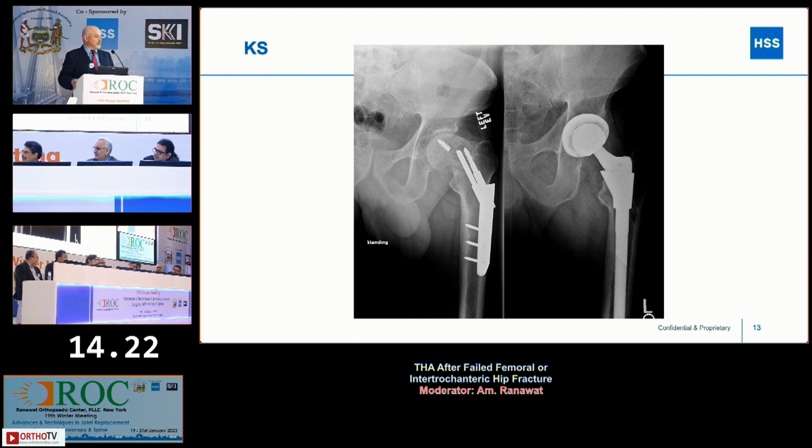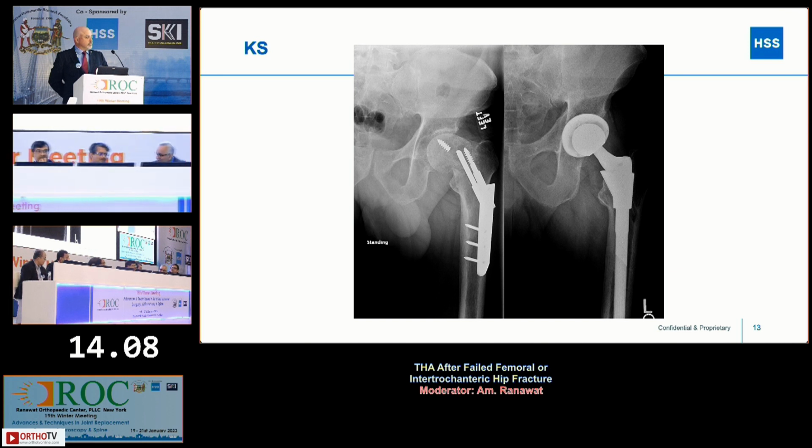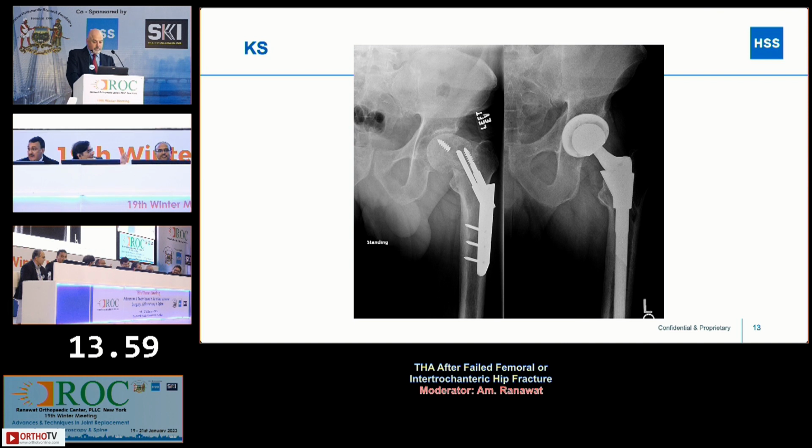For the nails, for the K nails and all, I think you need to split a little bit of femur. It will come out, but you need to have longer stems as a part of preoperative planning. You need to have cables also when you're taking up these cases. The K nail only has one slot. If it breaks that, you can't do anything about it. So for an incarcerated K nail, the only thing that can take it out is you need to split the femur a little bit. Yeah, then only it will come out. It will not come out otherwise.